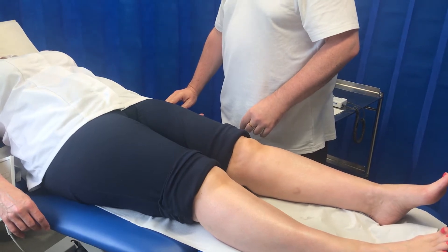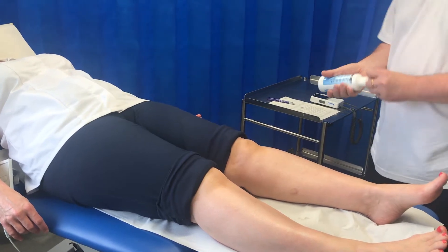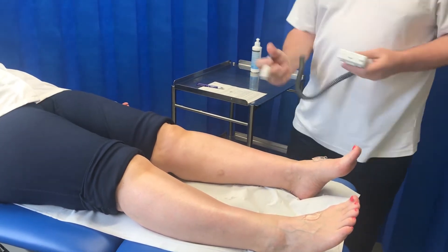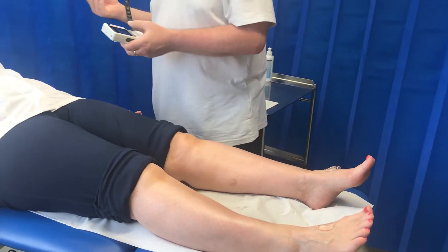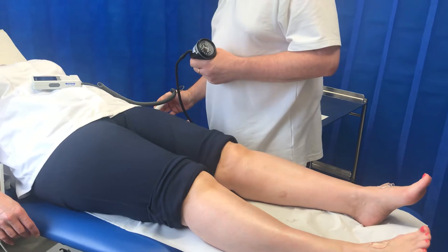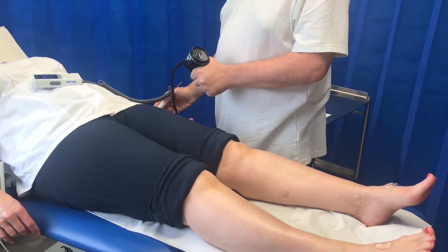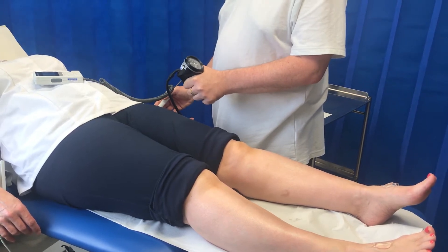I'll take a pulse — I can use either the radial or the brachial pulse to listen to. In this demonstration I'll use the radial pulse. I'll usually put gel on the feet first and come back to pick up more gel. So I'll get some gel on my Doppler, turn the Doppler on, and ask the patient if it's okay to rest the Doppler on their wrist. I'll anchor my hand to the patient's wrist, pointing the Doppler up to about 45 degrees towards the heart.